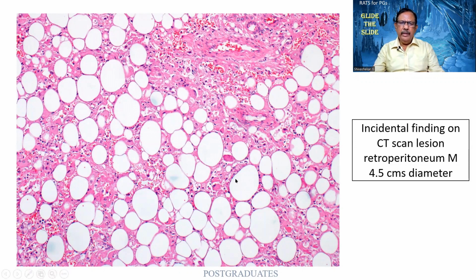One thing that is striking me is large vacuolated cells, something like what we draw in a lipoma, maybe of varying sizes. They are being incompletely separated by fibrous tissue, and some of them are spindle enough to give me an idea of a smooth muscle or a myofibroblast.